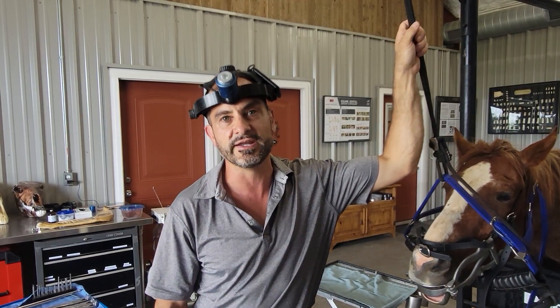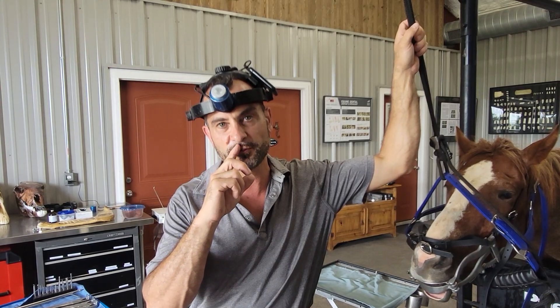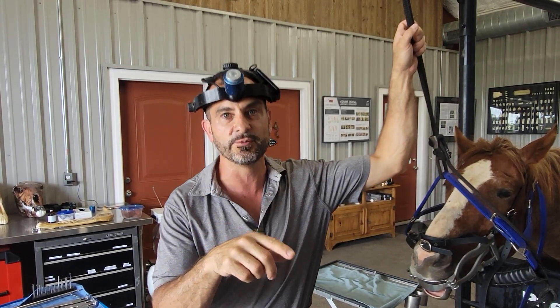This was a horse that was referred for evaluation of a 109 that was suspicious on oral exam and seemed to have some open pulps. We'll show you what it looks like in the mouth.